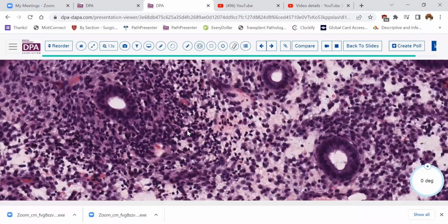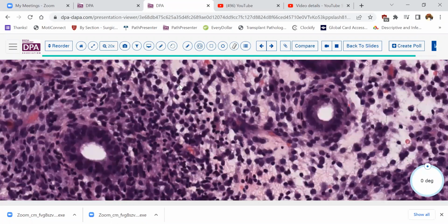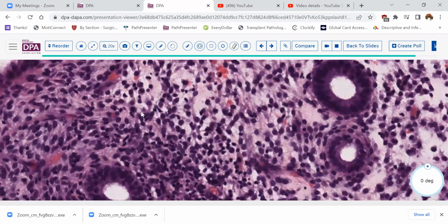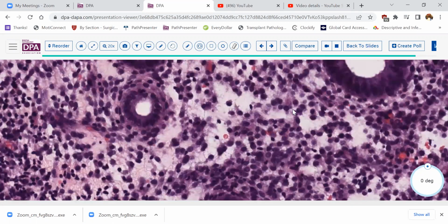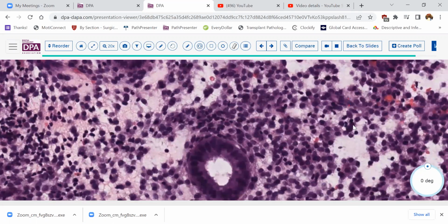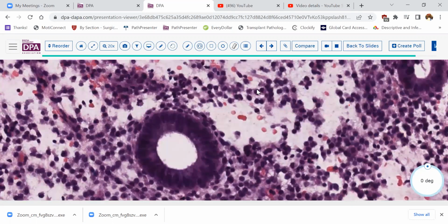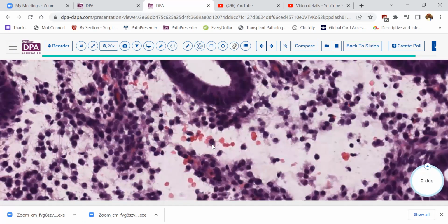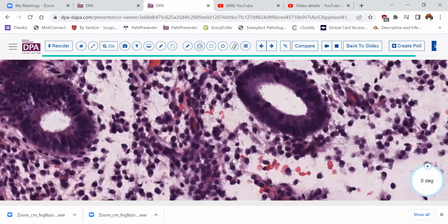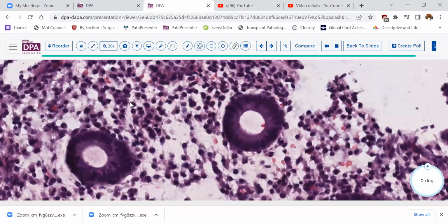Here's an area where perhaps you can sense that there's a few extra inflammatory cells. And as we look around, there are many times when these stromal cells can look a little bit plasmacytoid. And usually that's not something that I think of unless the symptoms or the story is there. And here you see a little bit of breakdown along with this. And so doing the immunohistochemical stains for me is kind of a confirmatory way, or a more confident exclusion, of chronic endometritis in these cases.